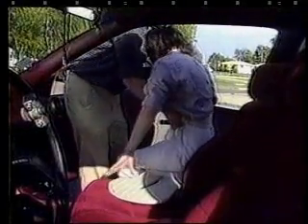If you're placing the patient in the front seat, move the seat as far to the rear as possible, giving yourself maximum room to maneuver. Vice versa, if you're placing the patient in the rear seat. Plan the placement of the wheelchair so it is at the proper angle and as close as possible to the transfer surface. Mentally track the path the transfer will follow. Please note that an automobile with its door handles, dashboard, and abrupt angles will increase potential for coming in contact with the seat, possibly impeding the transfer.